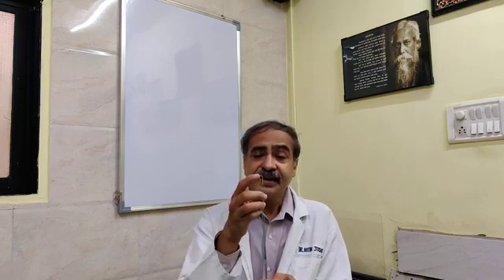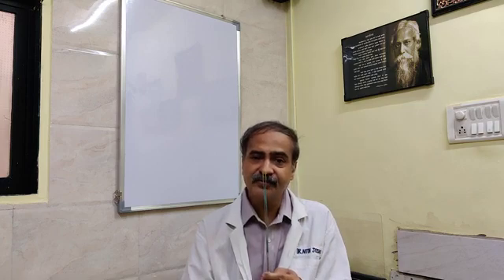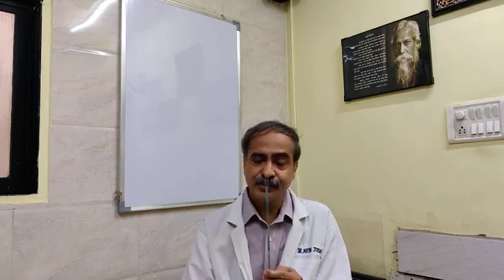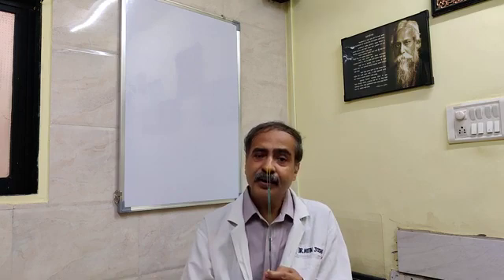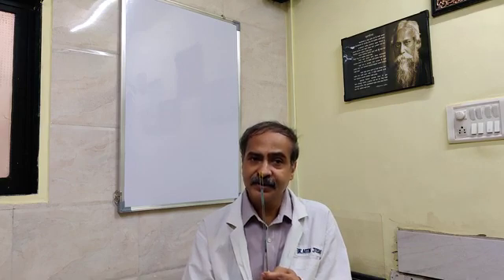When you are mounting this particular electrode, the field of vision gets restricted because of the shape of the knife and hook. So before you mount the active hook, you have to define all the landmarks, particularly in case of bladder neck incision. You have to define the bladder neck and interureteric bar.